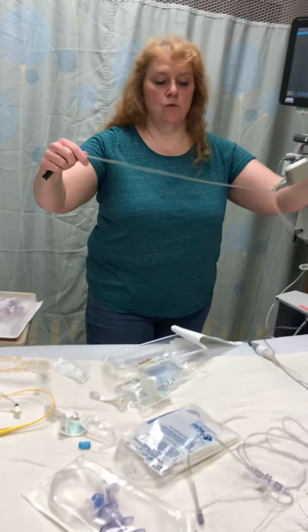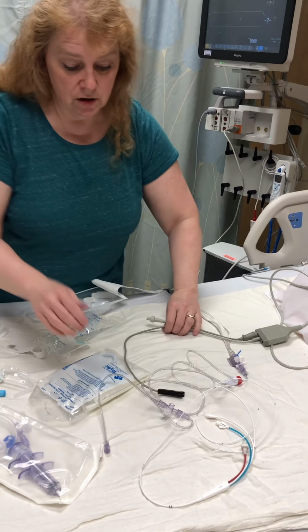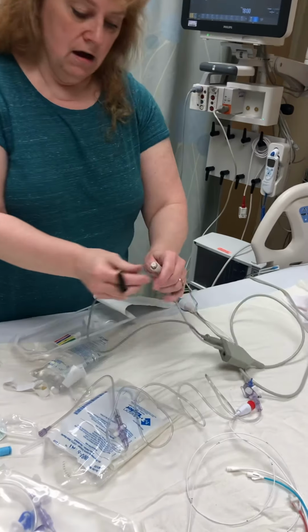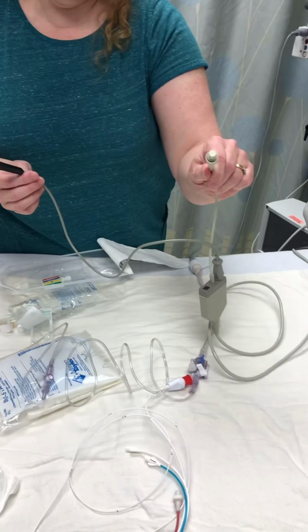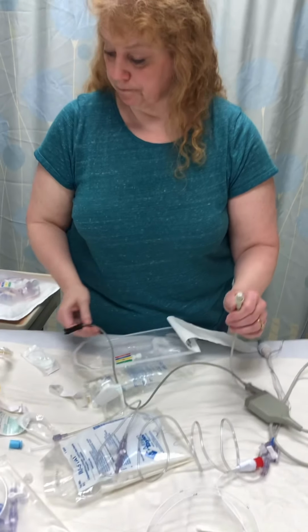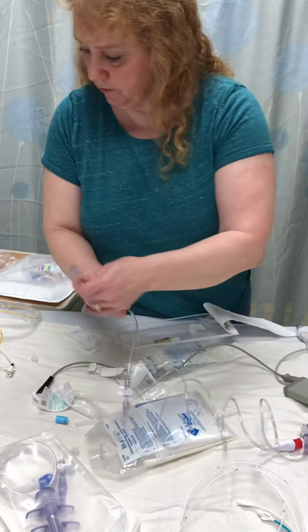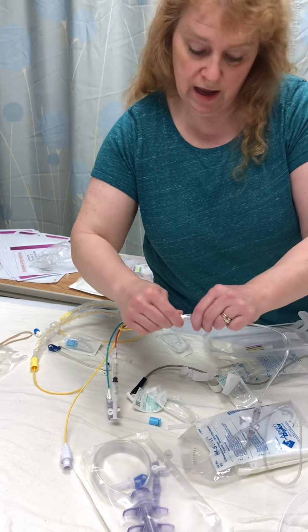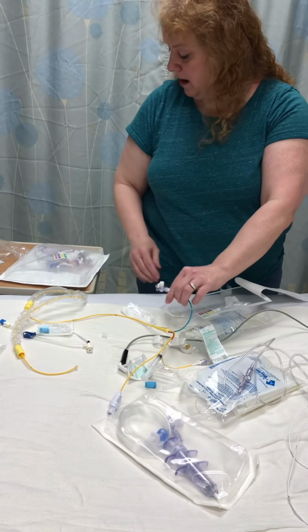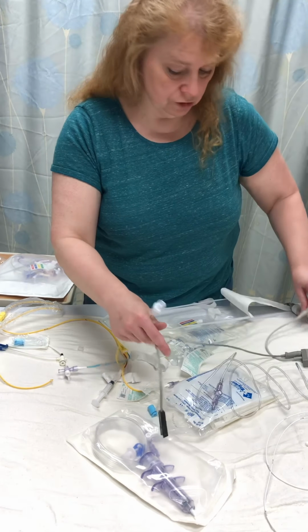And then you want to make sure you're taking a look at this. This is going to have 2 pieces to it. In your manual cardiac output, instead of the 2 thermistor ports, you have 1 thermistor port, and then this goes where you're going to be checking your manual cardiac output. Okay, so in this, I'm going to attach this to here. We would have stopcocks. This is our manual cardiac output. And what we're going to do is this is going to attach to here.